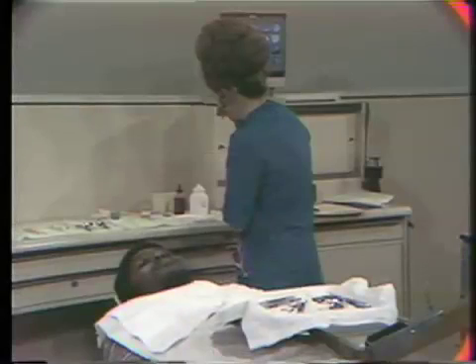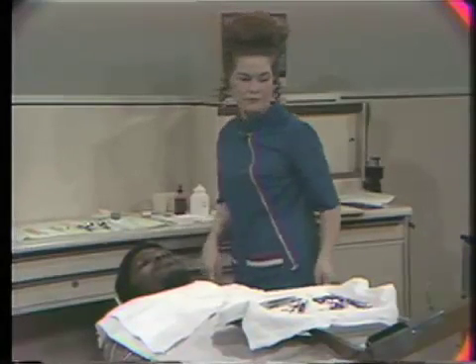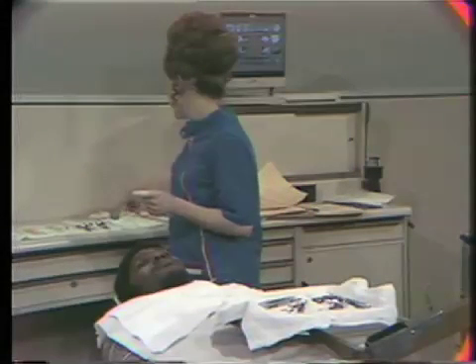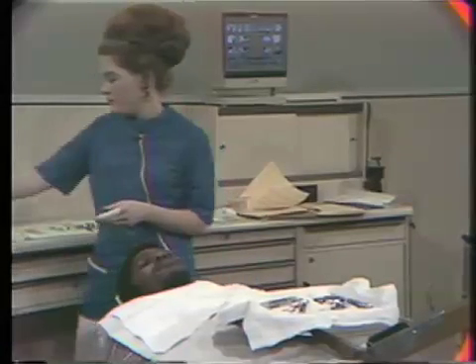Everything has now been completed, and the assistant will then put the patient forward, remove the drape, hand the instruction sheet that we talked about earlier to the patient, and this then completes a demonstration on the use of a dental assistant during periodontal surgery.